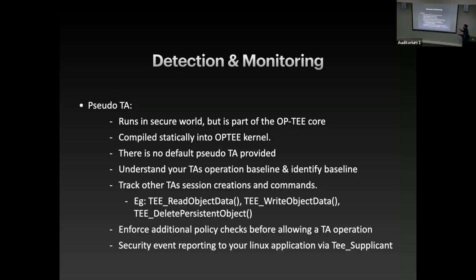So the concept is called pseudo trusted application. Think of it like a privileged container, where your container is running with higher privileges than other containers. So that's exactly what it is. It's built into the OP-TEE code. It's built into the kernel. It has the same privilege as the kernel.